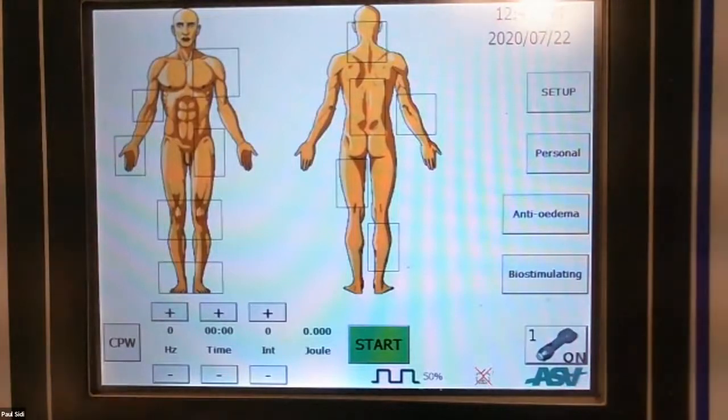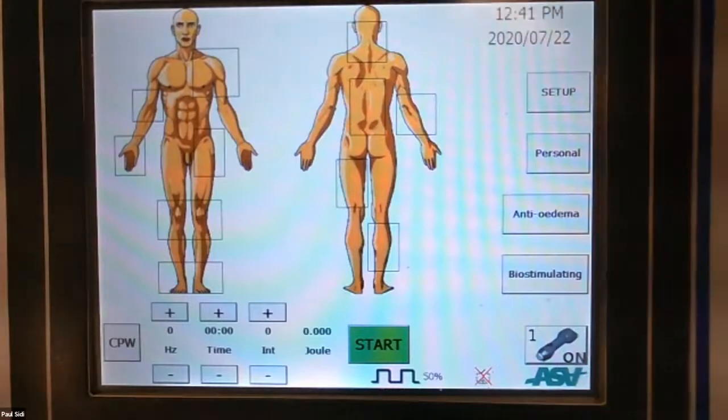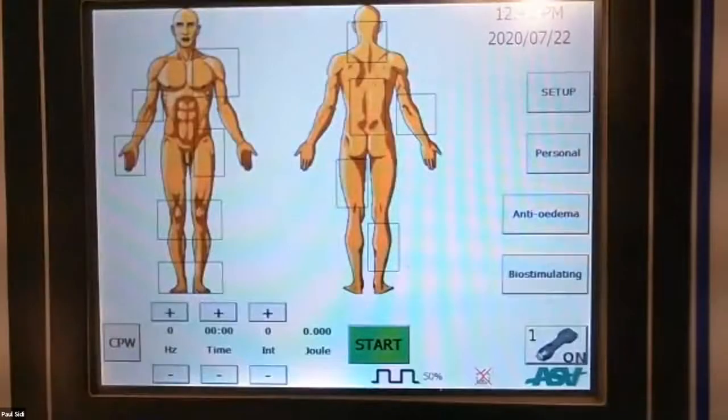What you'll always see is there's actually slightly higher joules on the settings for the same pathology on the Charlie. On the Charlie head, that is set at, I can never remember, is it 15 centimeters or 20? It's 20, I believe. It's about 6 inches, 6 to 7 inches. That's the difference. But it sends more joules in because it's from a distance and therefore some of that will be dissipated. So what reaches the skin and goes into the tissues will be the same. Does that make sense?